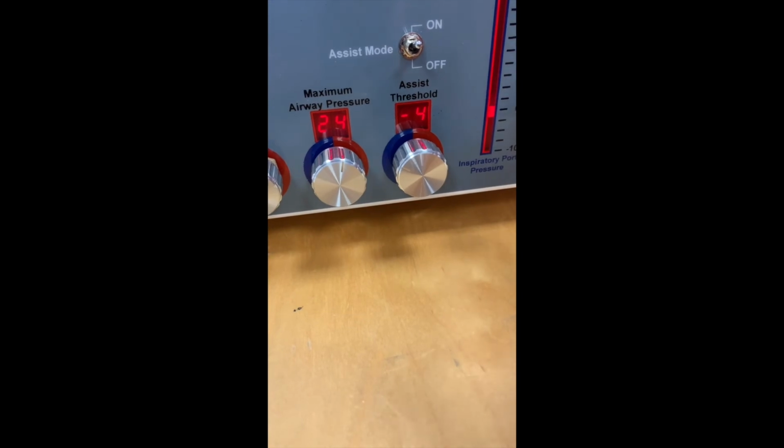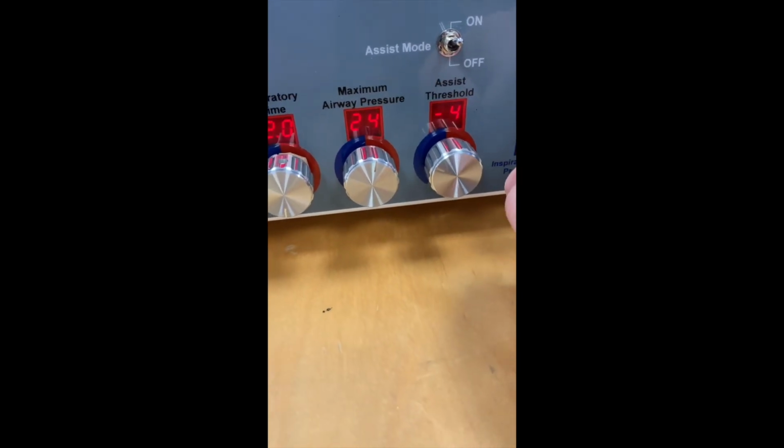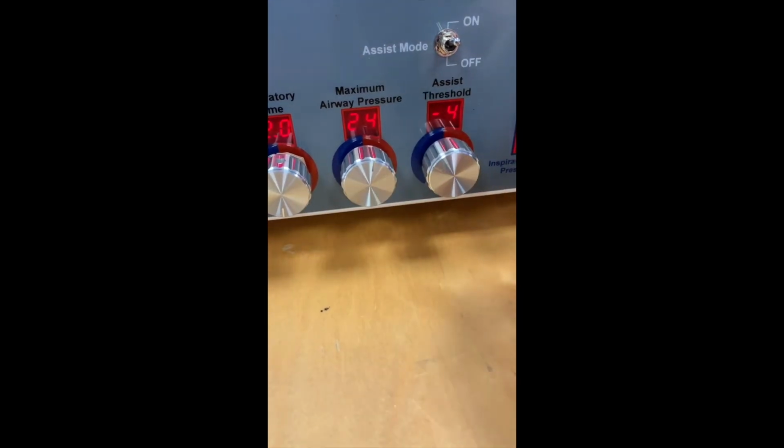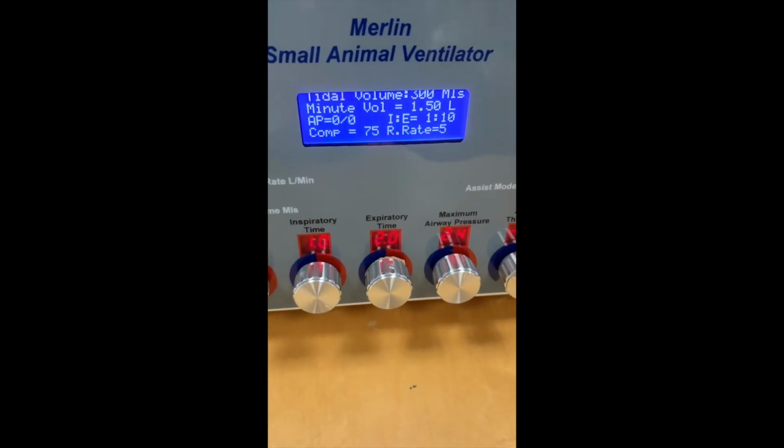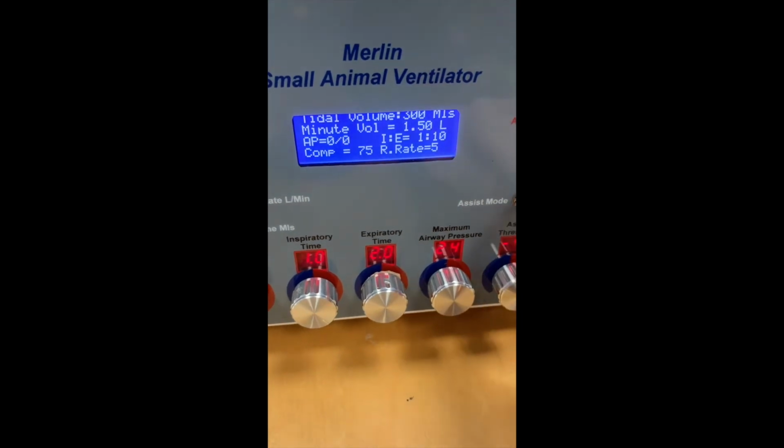When the breath is triggered, the full breath is delivered to the specifications and parameters already set up. So if you're pressure cycling, it'll deliver the breath to a pressure. If you're volume cycling, it'll deliver the breath to a volume. I'm just going to run this and show you the effect of setting the assist mode to on.